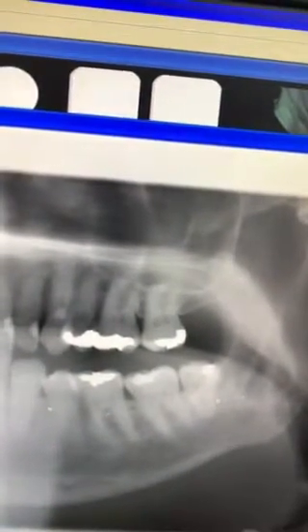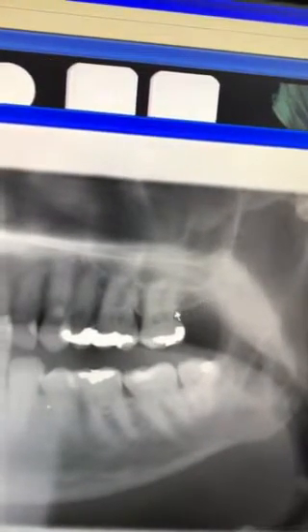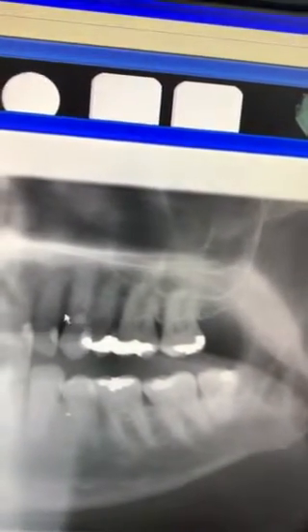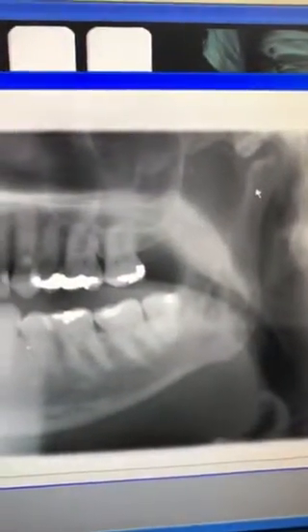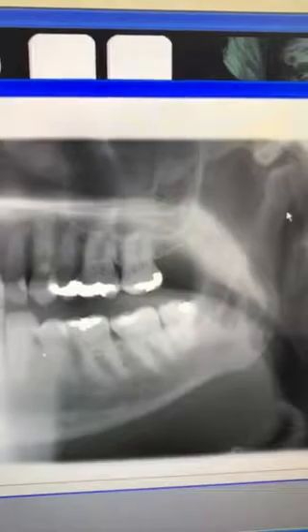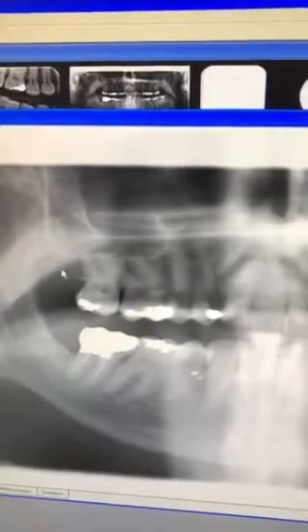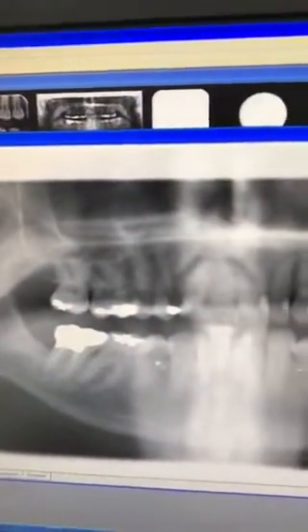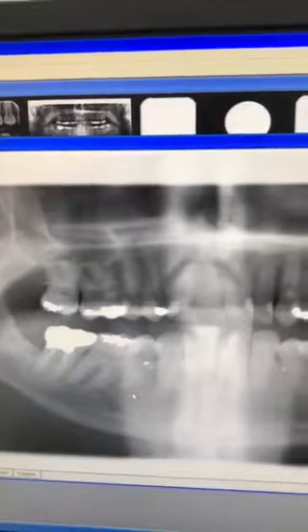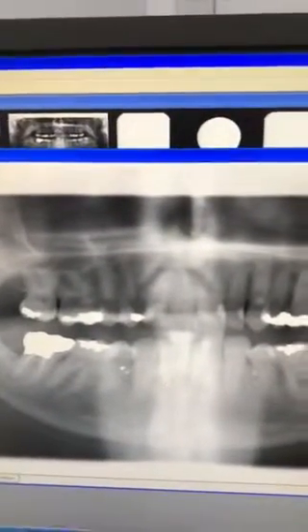On an OPG you can see the position of wisdom teeth and the proximity of the nerve. You can also assess bone levels around the teeth, the sinuses, the jaw joint, and what's going on with the rest of the bone around the teeth. It's a very useful type of X-ray for certain patients.